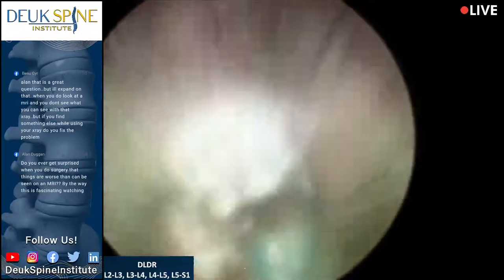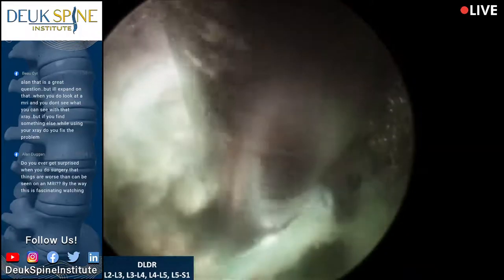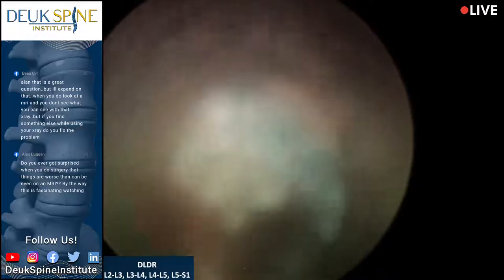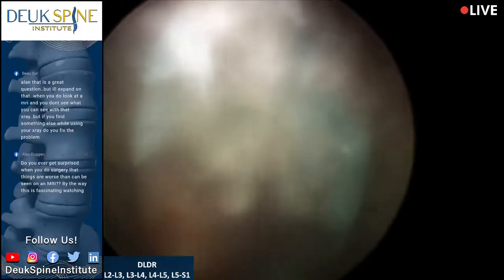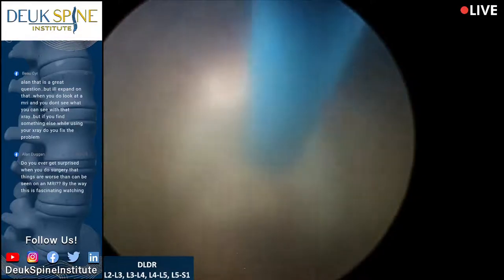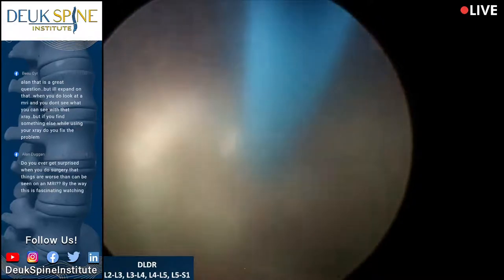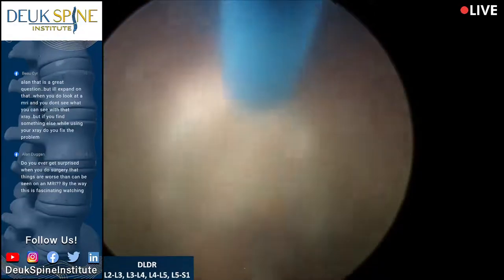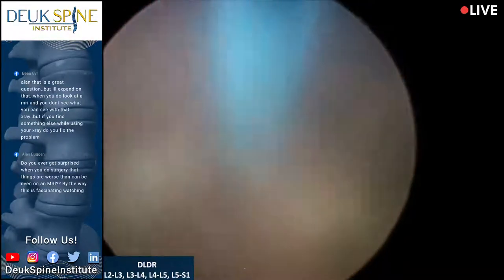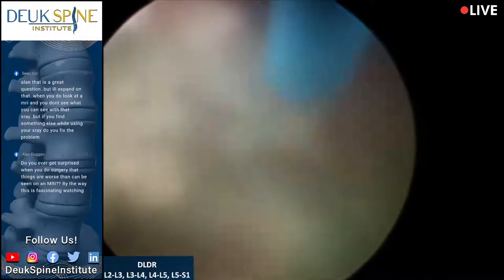This L3-4 was quite a big herniation, as a matter of fact, a couple of herniations. Okay, you guys doing all right? There's the tear that I wanted to debride. And I apologize for the poor visibility. It's due to just a little bit of oozing of blood, on a microscopic scale, basically, but it's enough to cloud the view. Almost done with this disc. There's another piece of herniation right there.